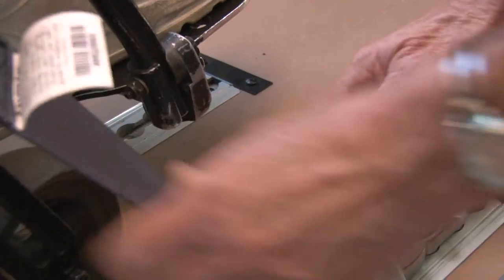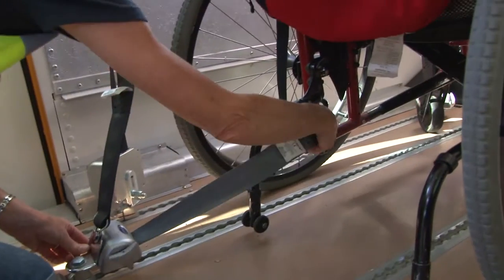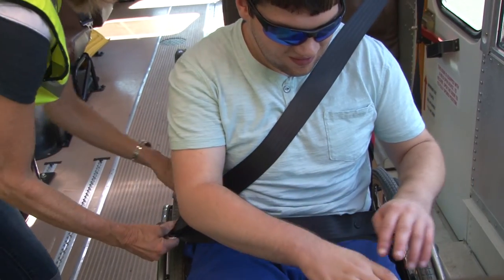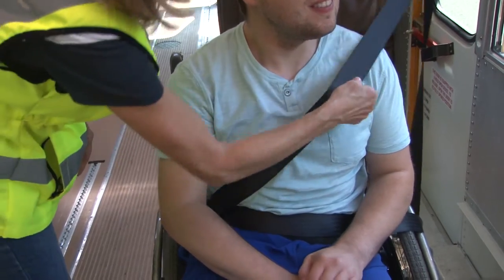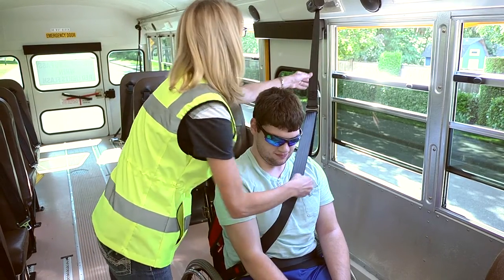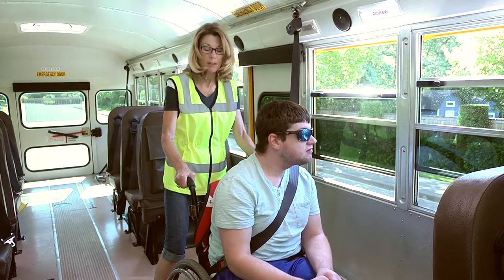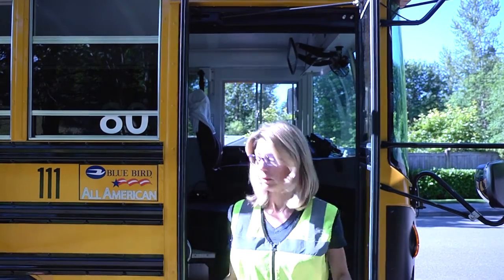Tie down the chair using all four-point tie-downs — two front and two in the rear. Store wheelchair trays if applicable. Secure the shoulder strap, making sure straps are not twisted and are not rubbing against the child's neck. Test securement by gently shaking or rocking the chair to see if it will move, and tighten straps as needed.